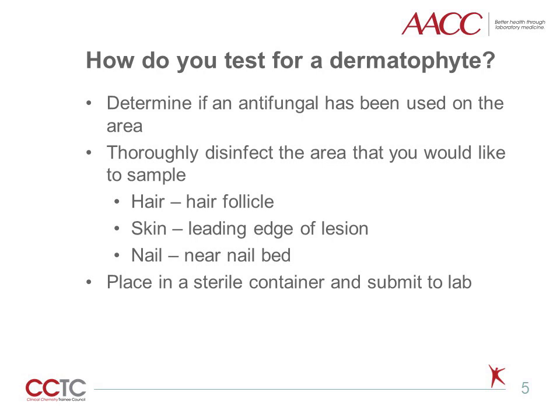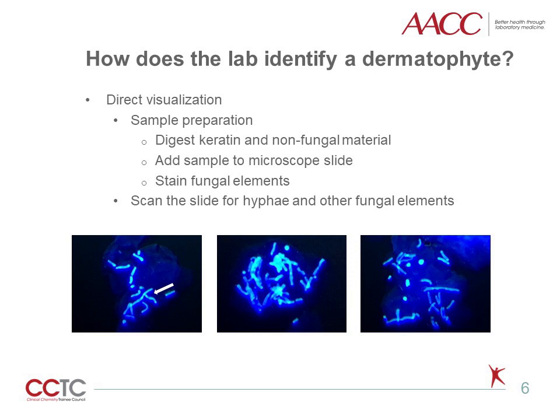These specimen types are stable at room temperature for several days. Do not refrigerate because dermatophytes are sensitive to cold temperatures. The first tool that microbiologists can utilize to ask the question, is this a fungal infection, is by direct visualization of the organism through microscopy.